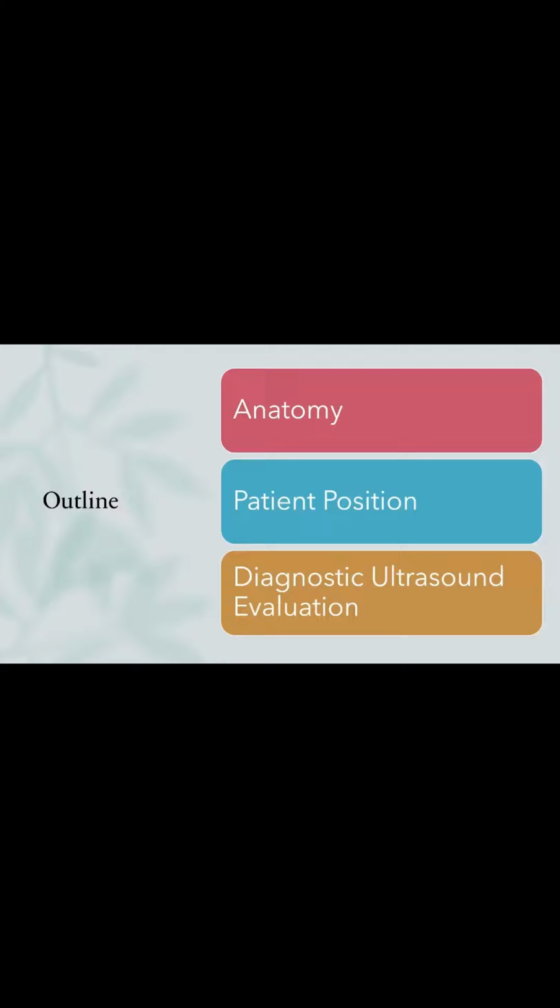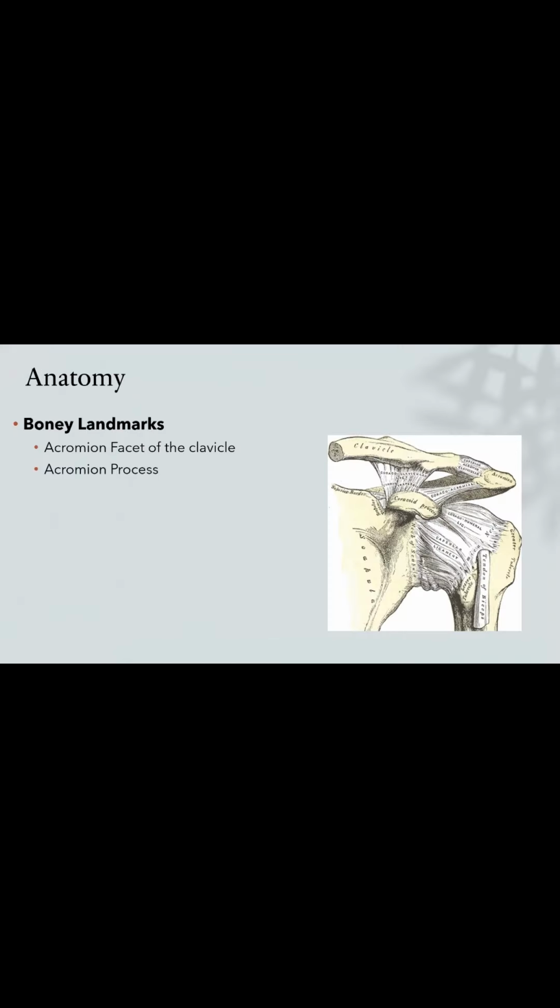My name is Alexander Alvarez, and today I will be instructing the use of diagnostic ultrasound for assessing the acromioclavicular joint. I will be going over the AC joint anatomy, the patient positioning, and the diagnostic ultrasound evaluation process for the AC joint.